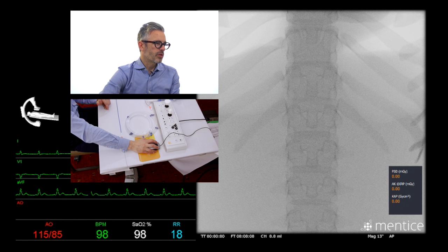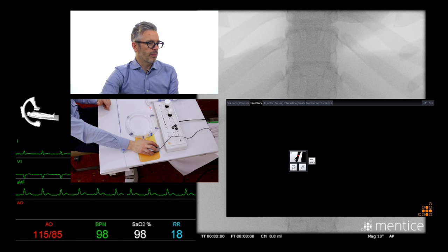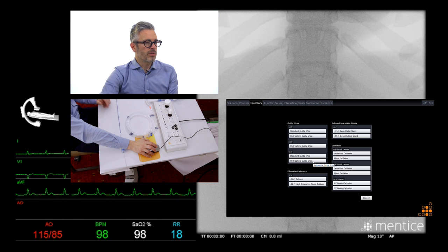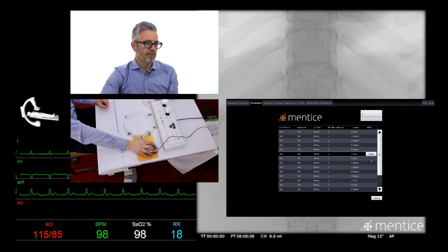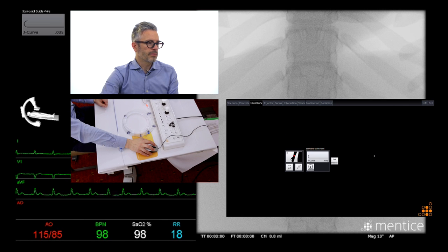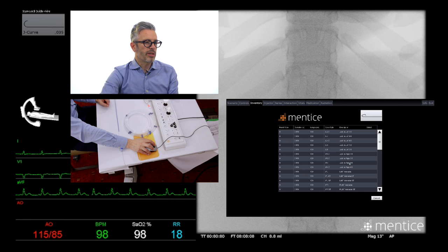Hello, my name is Alan Bagnall. I'm an interventional cardiologist and today we're doing a case of right coronary artery angioplasty. Our patient is a 40-year-old female and we're going to do this from the right radial artery. I'm going to select our inventory to begin with. I've chosen a 6 French right radial sheath and we need a guide wire to navigate through the peripheral vasculature. I'm going to choose a standard 035 guide wire with a J curve at the end for maximum safety. Next I'm choosing our guide catheter - a 6 French guide catheter with a Judkins right 4 shape.